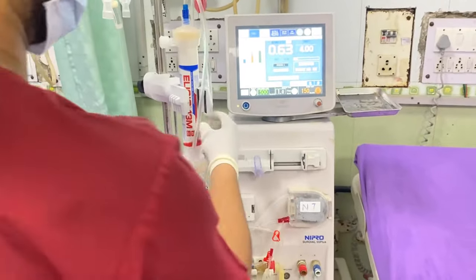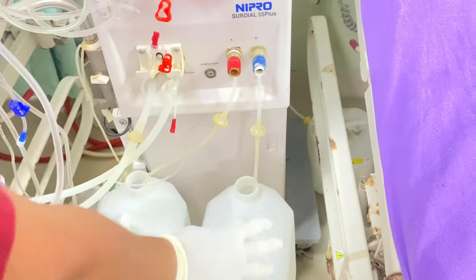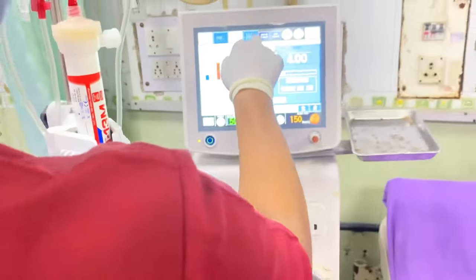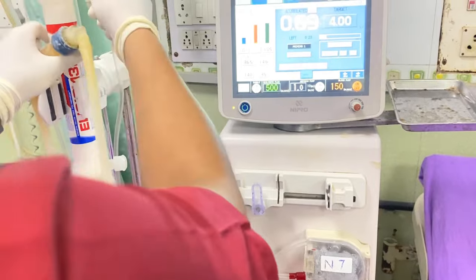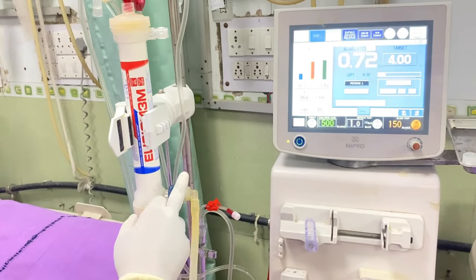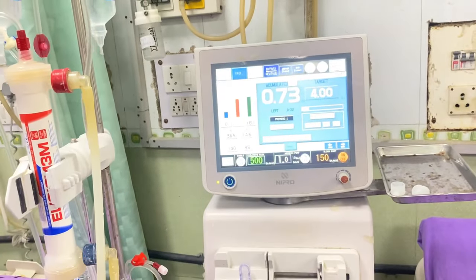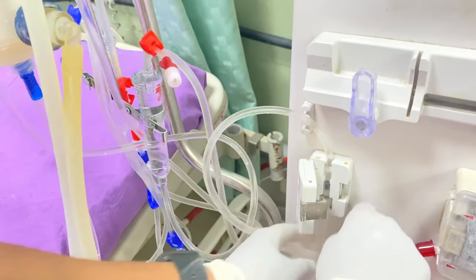Now the circuit is ready and we have to connect the dialysate to the dialyser. There are two cans: one is Part A, which contains all the electrolytes, and another is Part B, which contains sodium bicarbonate. Here are two sides — dialysate outlet and dialysate inlet. Where the blood comes into the dialyser, we have to fix the outlet of the dialysate, and this is the inlet. Blue is the inlet and red is the outlet of the dialysate. Last, we have to connect the venous line to the air detector clamp, which is necessary for the procedure.